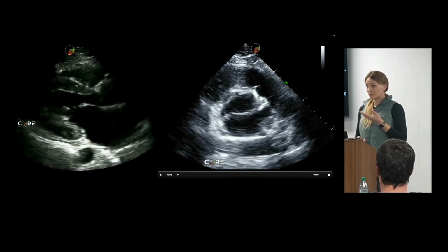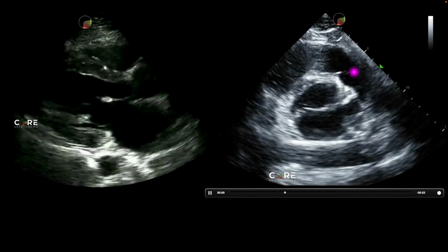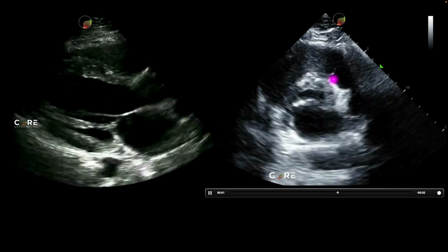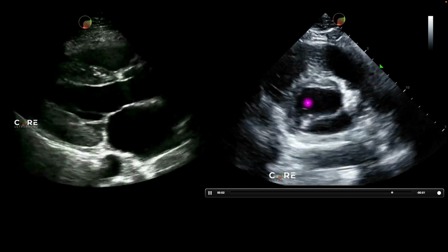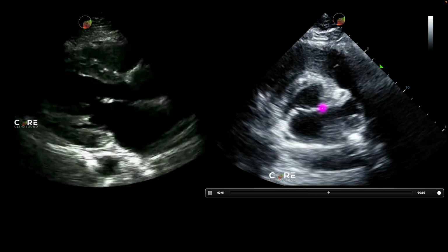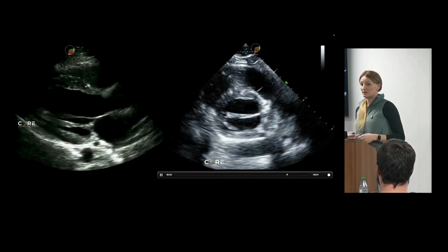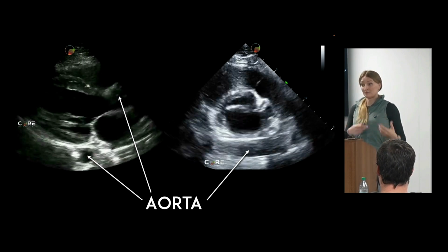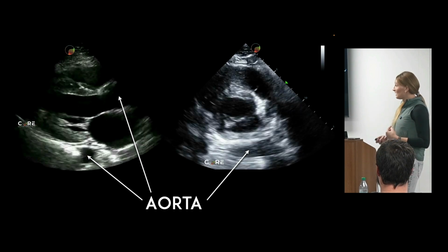So we're a little higher than we normally evaluate, than we normally teach. And that's why we can see the pulmonic valve, a really good pulmonic valve right here. And this is the tricuspid valve. And we're seeing a little bit of the aortic valve, just a little bit of it right here. This is the mitral valve off-centered, right? Because I can only see one leaflet. But the reason that we are showing you this view specifically is to show you how much of the aorta we can actually see on just parasternal views, right? We can see the ascending, we can see the descending on multiple views.